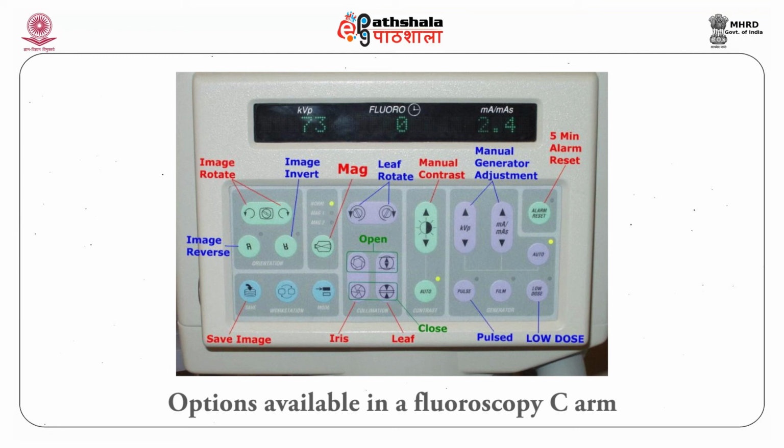Position and collimate with fluoroscopy off, tapping on the pedal to check position. Collimate tightly, exclude eyes, thyroid, breast and gonads when possible. Minimize the use of electronic magnification. Use digital zoom whenever possible.